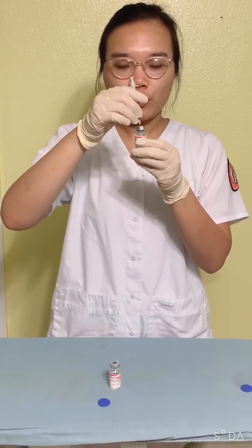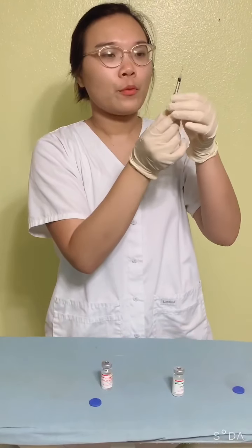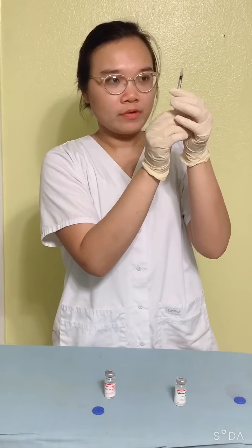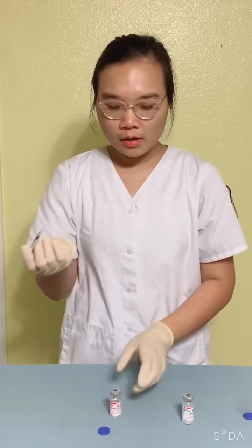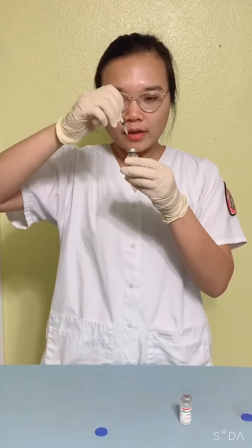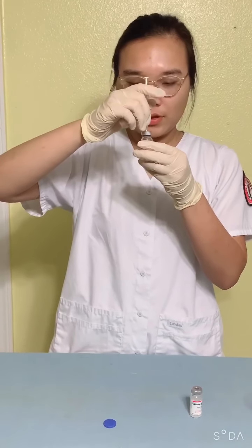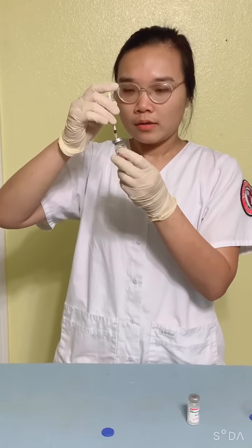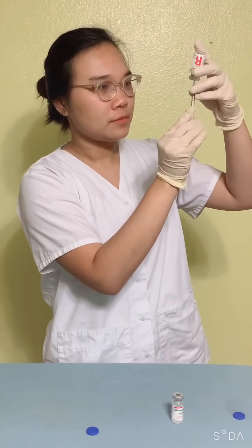I would withdraw the needle, and then I would aspirate the volume of air equivalent to the dose of the second medication, which is regular, and then I would inject the air into the vial. Then I would withdraw the medication.